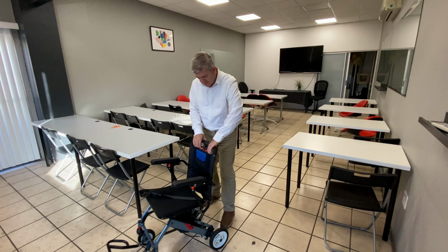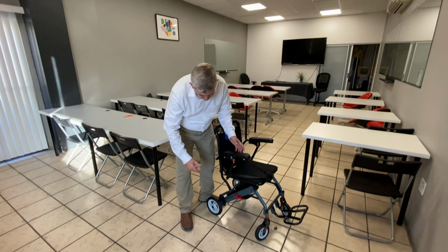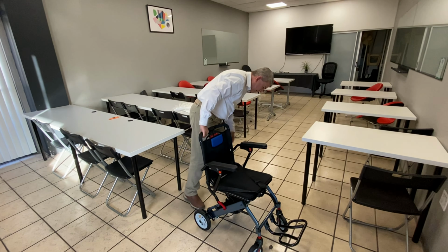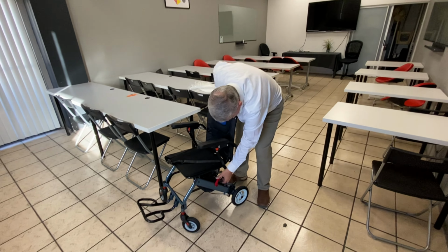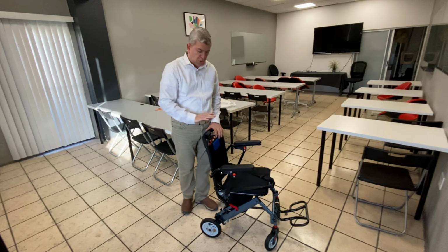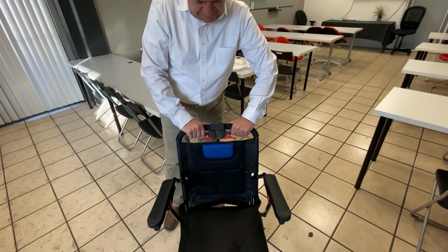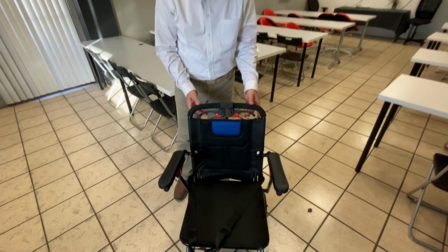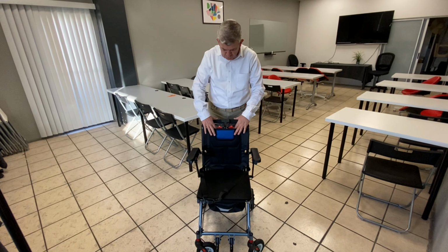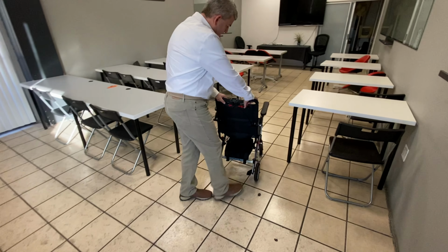It has a braking system. When you open it, you want to use this lock so it won't fall automatically over by mistake. Okay, and when you want the chair to be stopped somewhere, you can put the brakes, and they will stay on. The brake will stay on until you release them like this. Okay, so it's really easy to use.